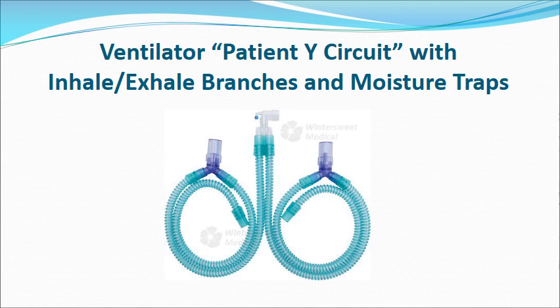Now, one of the things you'll notice is there is a difference between this patient Y circuit and the ones we're going to be using for the lab. One of the key differences is you don't see the two small tubes that are on our patient Y circuit, which measure the inhalation and exhalation pressures and take that information back to the ventilator.